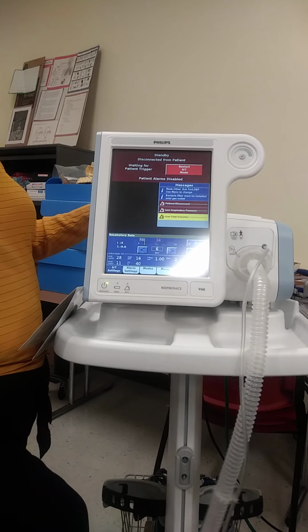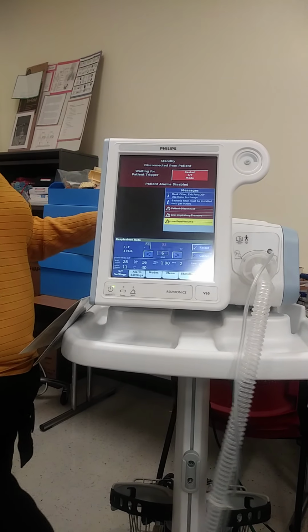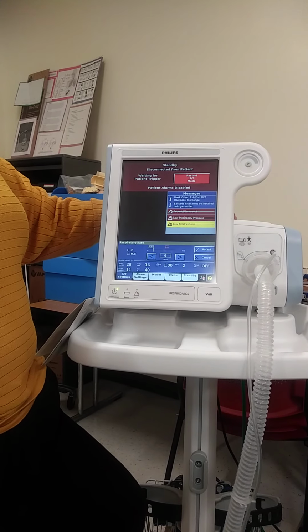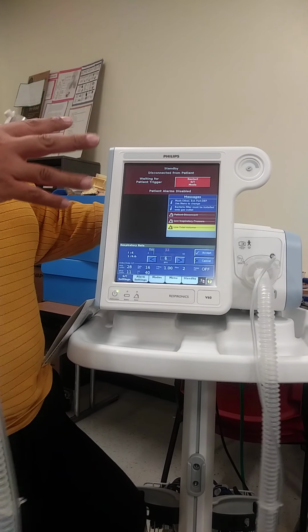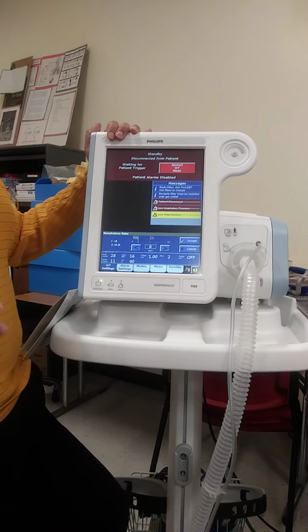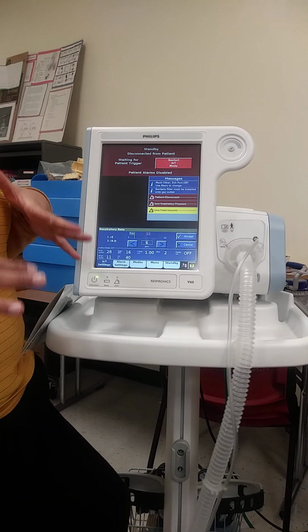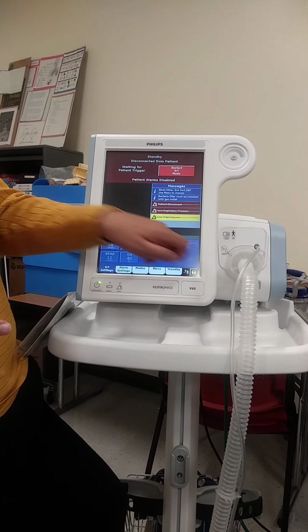Because if I set it higher on top of what they're doing, they're going to be very asynchronous. So the way you have to think about it is I use this more for patients who are breathing a little bit slower on top of what they're doing and help them blow off any CO2. But if somebody comes in huffing and puffing, and they need help with their work of breathing, I usually set it at 6 or 8. Okay? So good question.